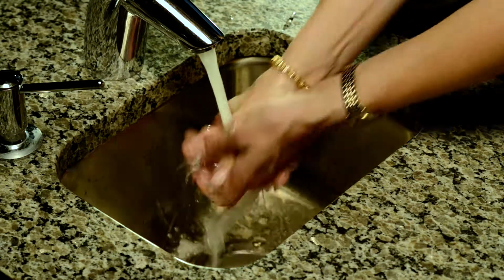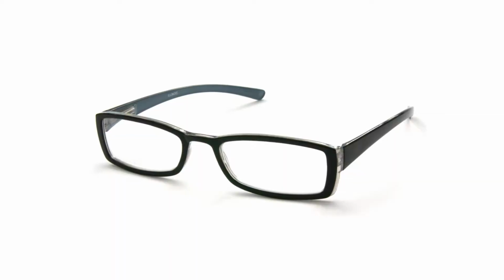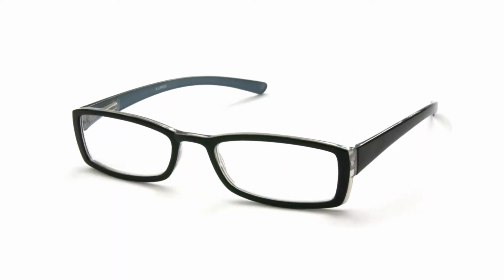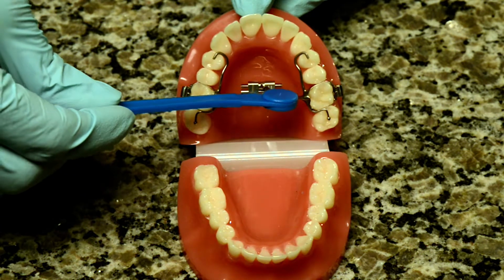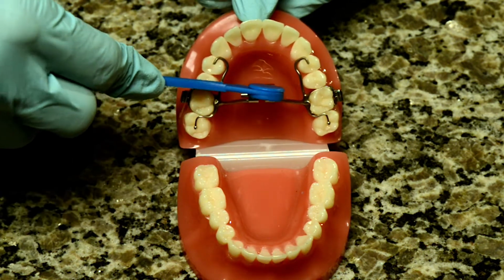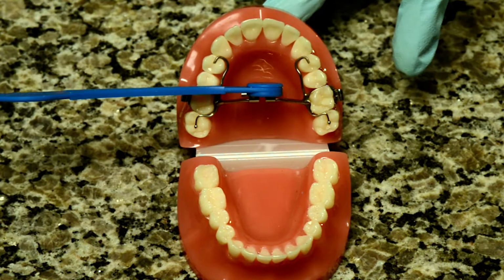Wash your hands. Have your child lie with his or her head on your lap. Be sure to wear your reading glasses if you need them, and have very good light. Insert the key. The key is inserted into the hole in the appliance as far as it can go, and then push to the back of the throat to spin the wheel.